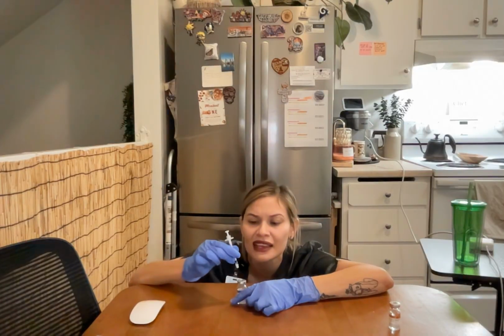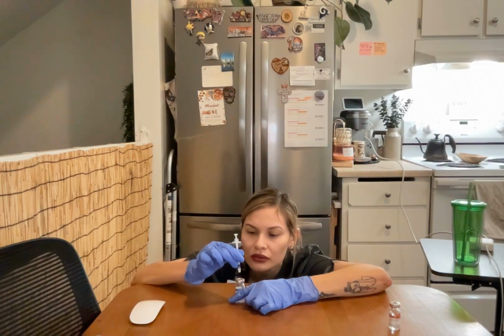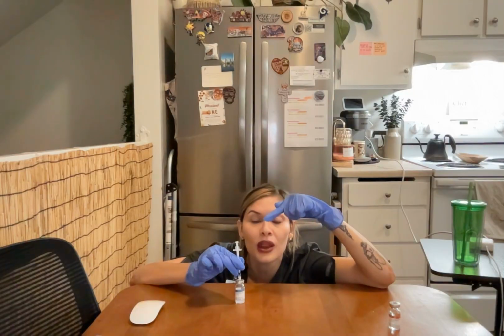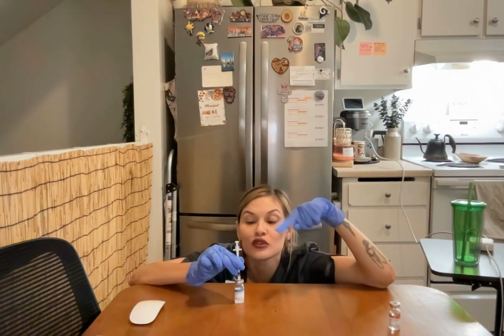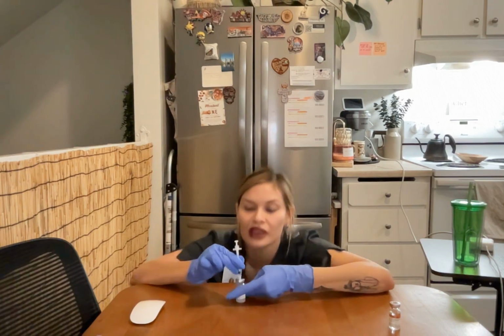to insert the syringe into my NPH vial. While I insert the syringe, I make sure that I don't push the plunger so the regular insulin will not get injected into the NPH vial.